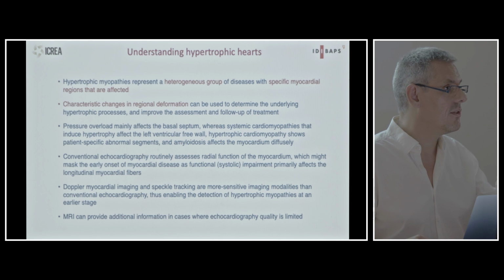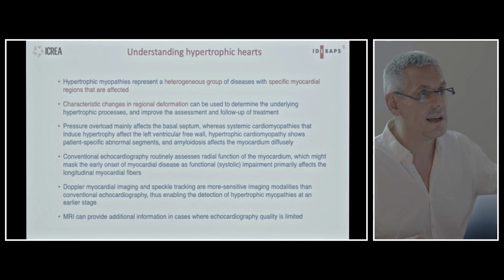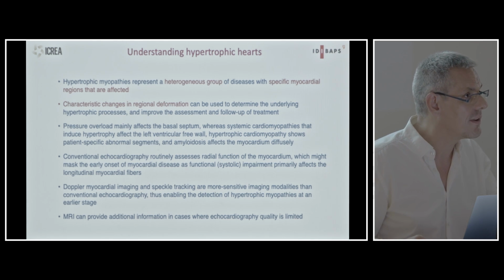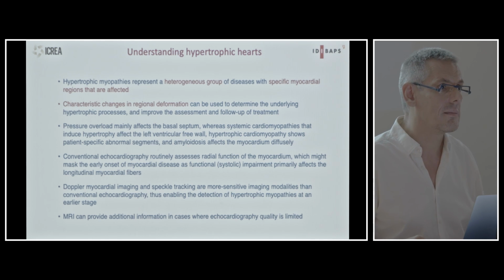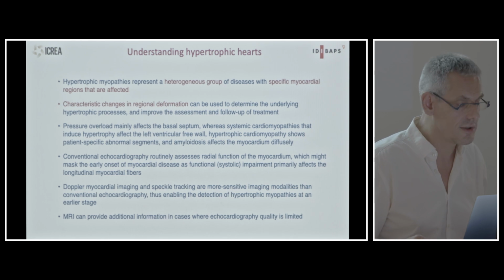So important, again, what you need to do in hypertrophic cardiomyopathy, just like you need to do in CRT, is try to look for specific signs of the underlying etiology. And each of them, when you start thinking about tissue changes, loading changes, then the cardiac mechanics will have a specific pattern that once you recognize it, you can actually use it diagnostically very well.